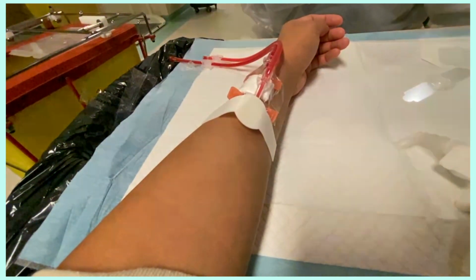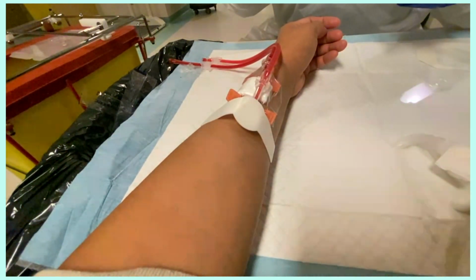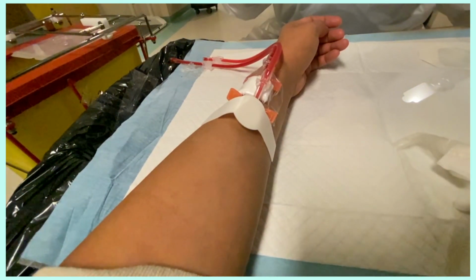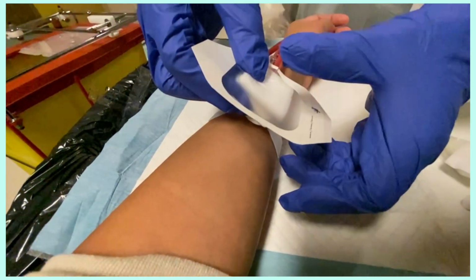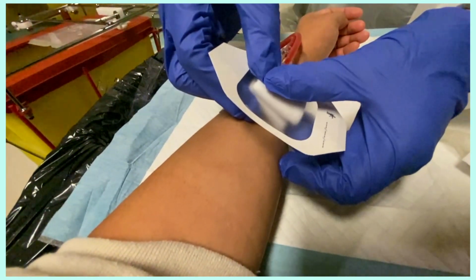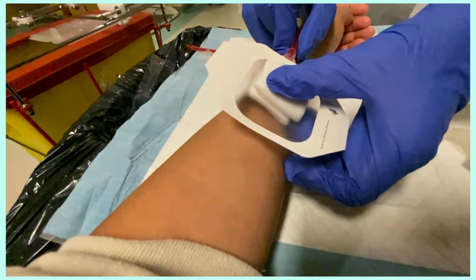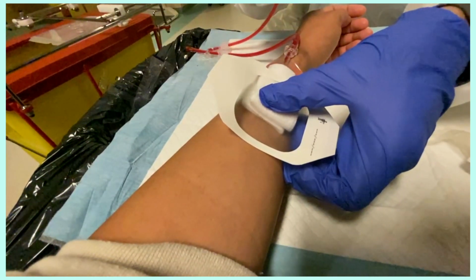The second is they get a gauze and they fold it in four and they put it right in the middle of a clear dressing, and they put that dressing on top of the stopper. But just before she fully places it down, like pushes it down, she takes out the needle, which, if you can see, on top of her fingertips, it's like these plastic things.